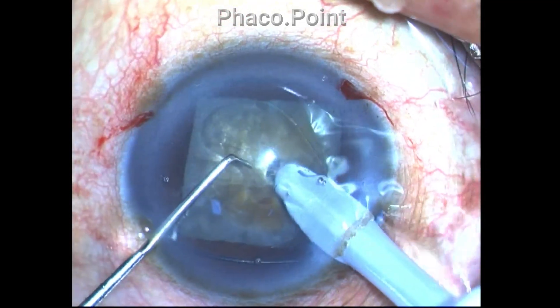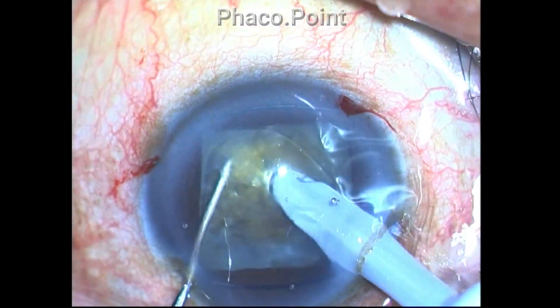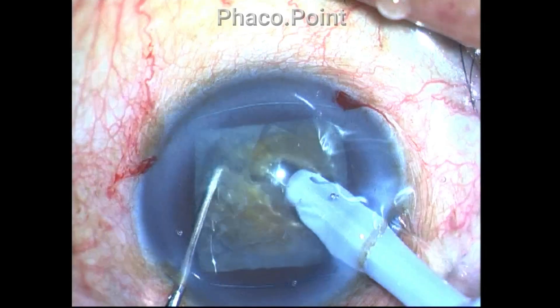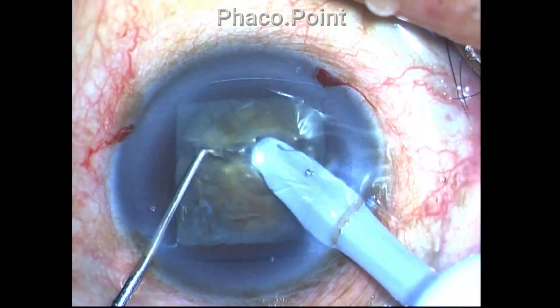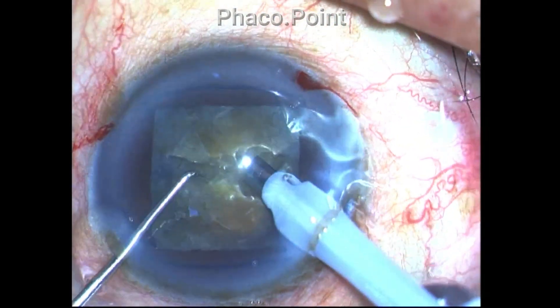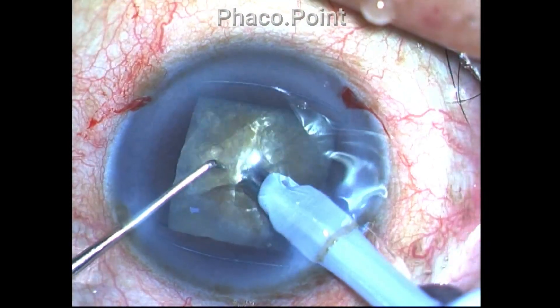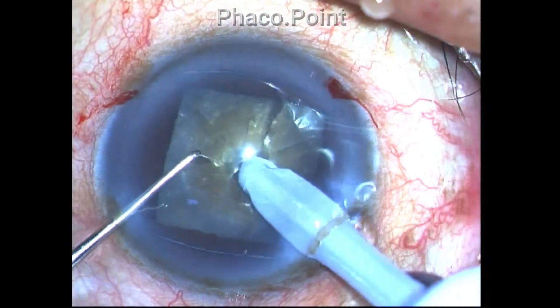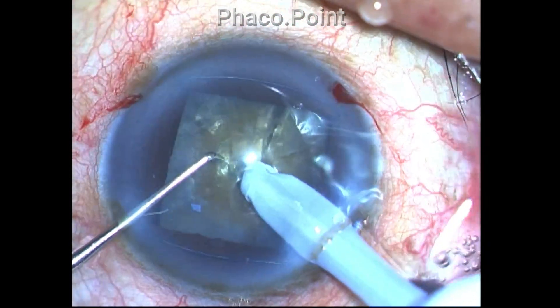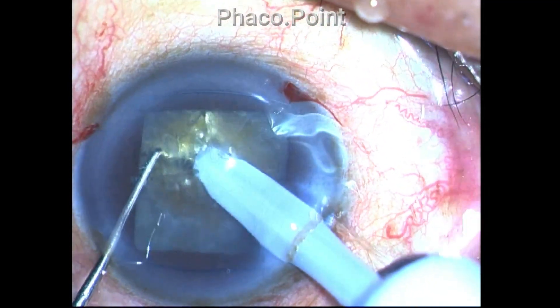The nucleus disassembly technique I am employing is a direct chop technique using the paddle maneuver for separation of nuclear fragments. I expose the phaco tip to about 2 millimeters and use a steep angle of attack to drive the phaco tip through the horizontal midline of this nucleus before attempting to crack it and separate it through and through, including the posterior plate.